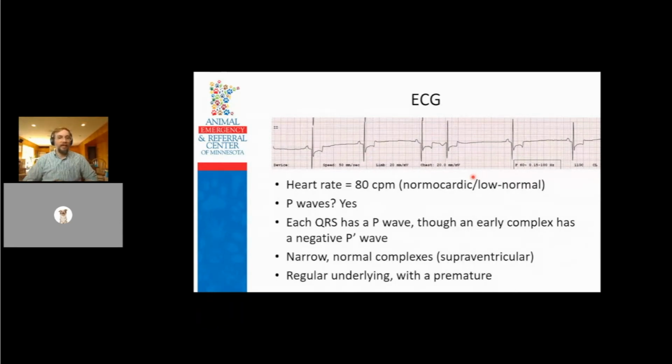The sinus node sits in the right atrium, and lead 2 sits on the left leg. So when your sinus node fires and your atria get depolarized, the signal's going towards lead 2, so that's why you get positive P waves. If you have a negative P wave, it's probably starting on the left and then moving away.